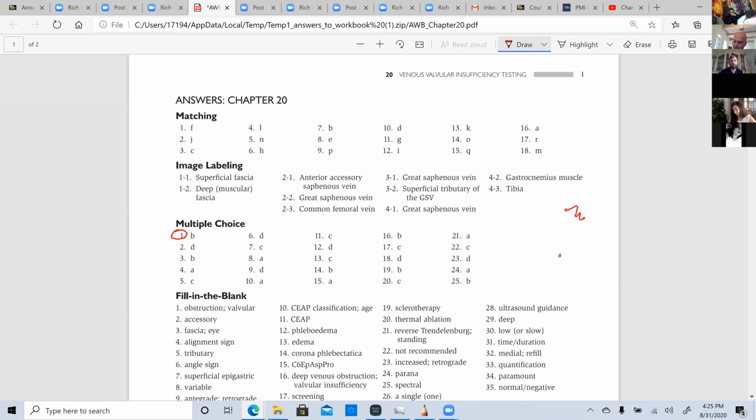The reason I say this is a bit of a trick question is, are they talking about the technical difference between proximal and distal or the real life application? In real life application, the groin is proximal, the ankle is distal. But technically it's the other way around. So that gets a little confusing. So you guys understand this one though? Cuff is distal. Yes, that makes sense.